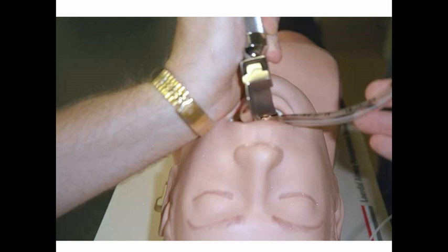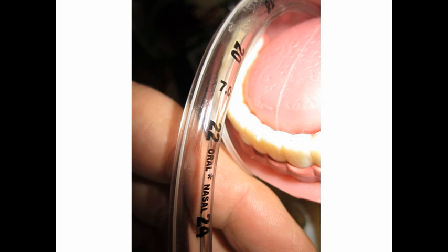You pick up the endotracheal tube at its midpoint and pass the tip of the endotracheal tube along this corridor that you have created on the right side of the patient's mouth, all the way to the glottic opening. In the majority of cases, the tip of the endotracheal tube will pass easily through the glottic opening and into the trachea, and our aim is to stop advancing when we envisage in our mind's eye that the tip of the endotracheal tube is probably close to the mid-tracheal point. And the guidelines earlier, 23 centimetres at the incisor teeth for a man and 21 for a woman, are very helpful.